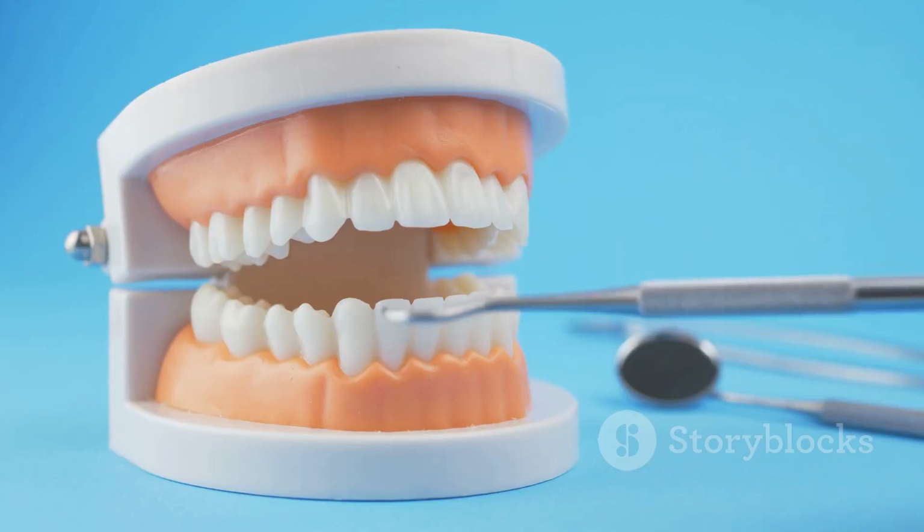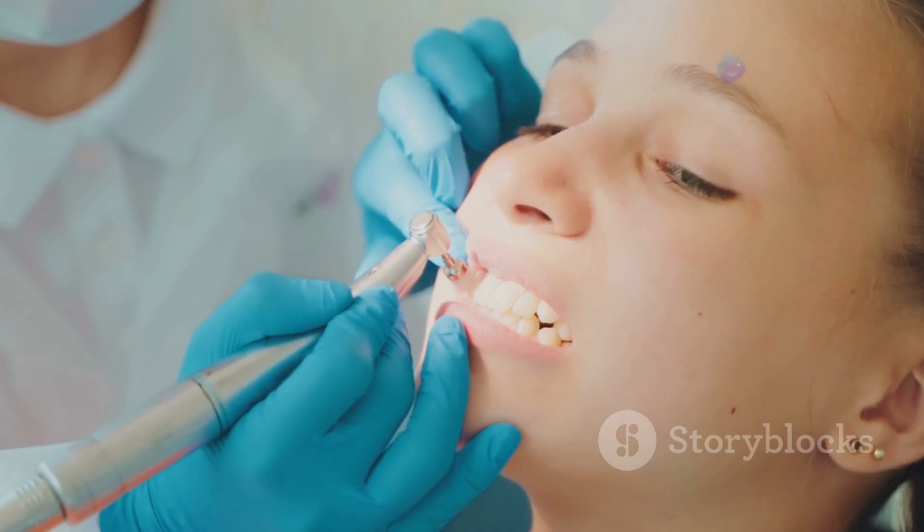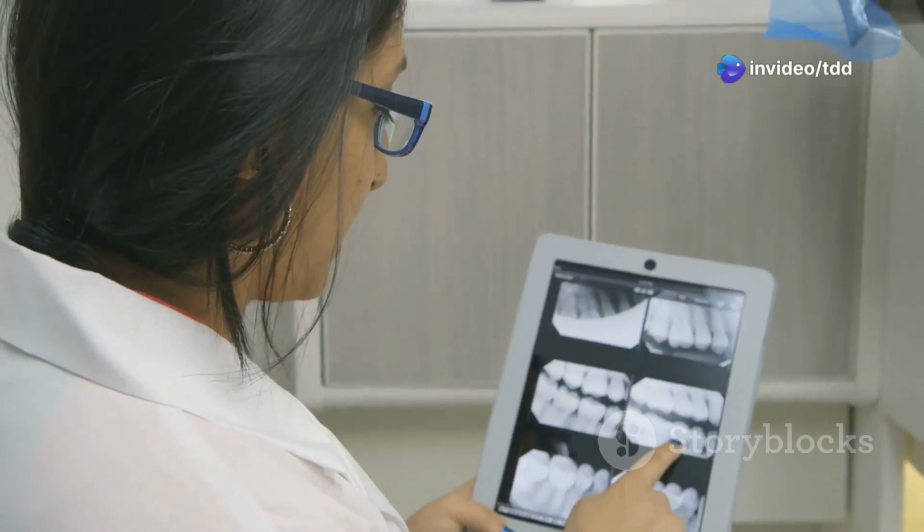B. Long buccal nerve block. Purpose: targets the buccal soft tissues of the molars. Where to inject: into the mucosa distal and buccal to the last mandibular molar. Landmark: the retromolar pad or buccal shelf.